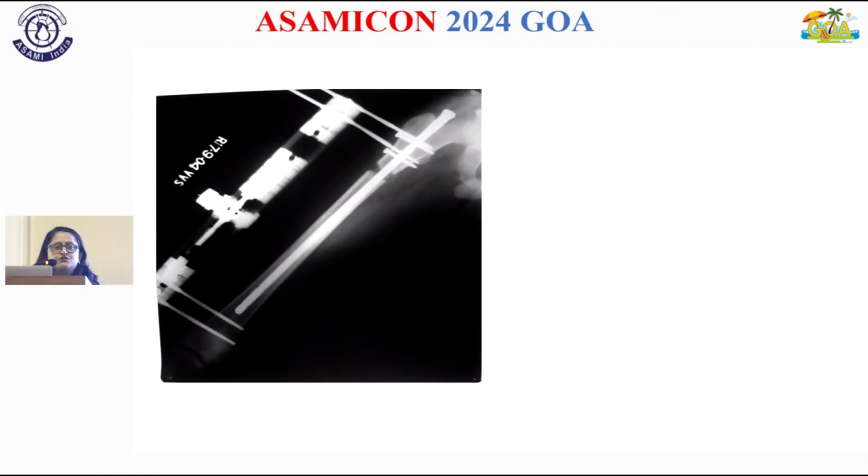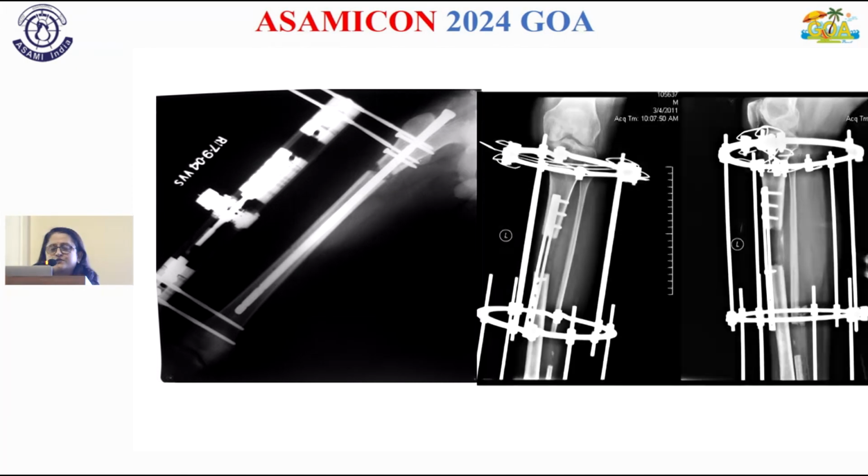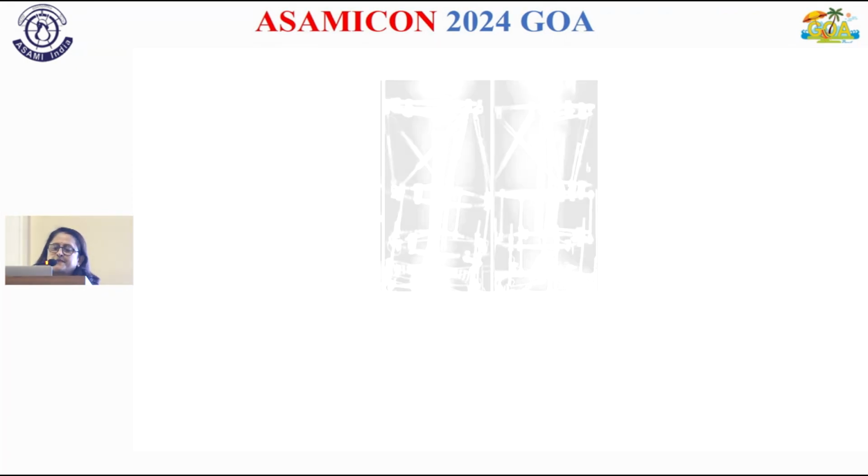So the first in this quest was lengthening over nail, introduced and popularized by Dr. Herzenberg and Dror Paley. Second was lengthening over plate.